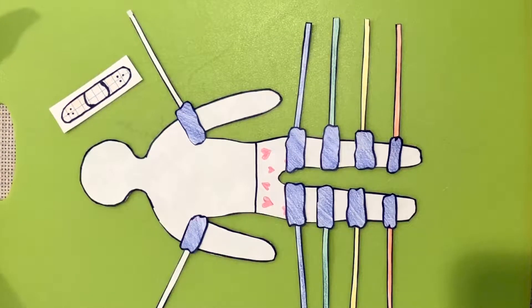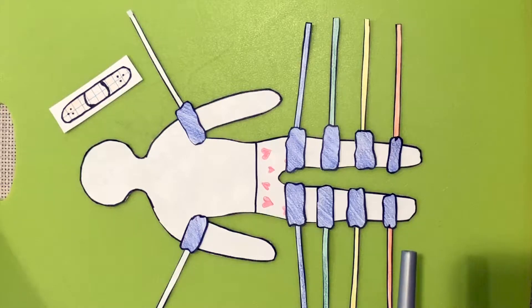The machine used at my clinical site has color-coded hoses. White is used for brachial, blue for high thigh, green for low thigh, yellow for calf, and orange for ankle. If a digit is needed, then a black hose will be connected. After asking the necessary questions and explaining the exam to the patient, you will begin with the brachial pressures.